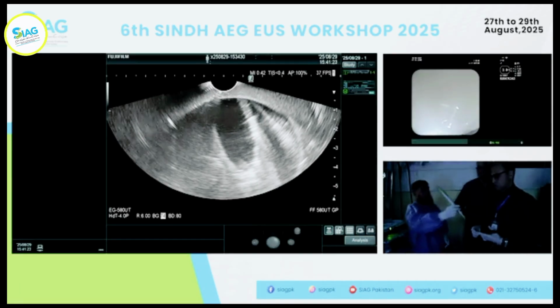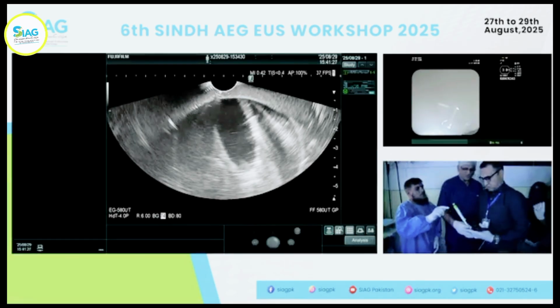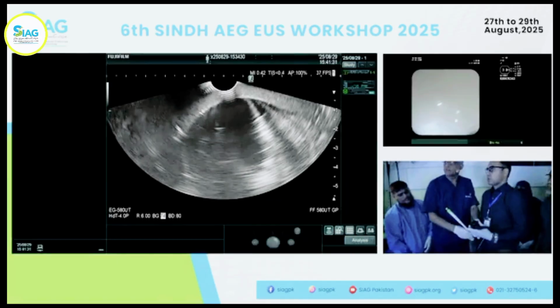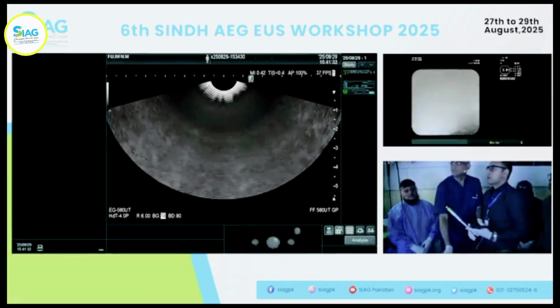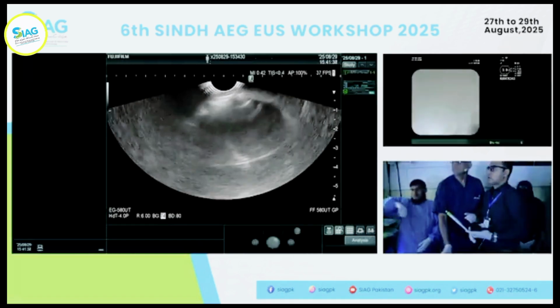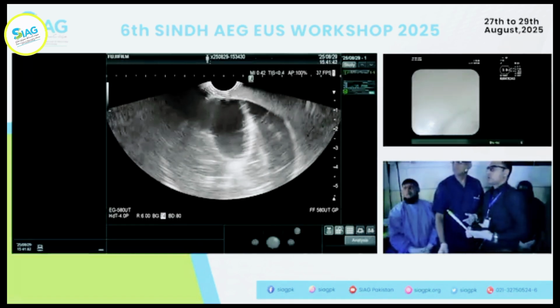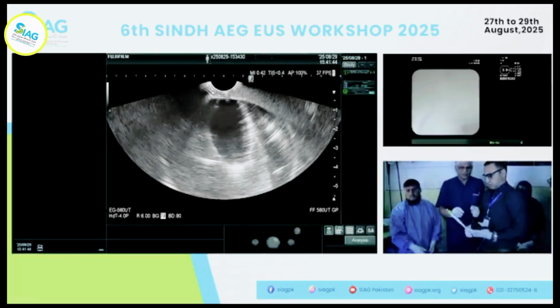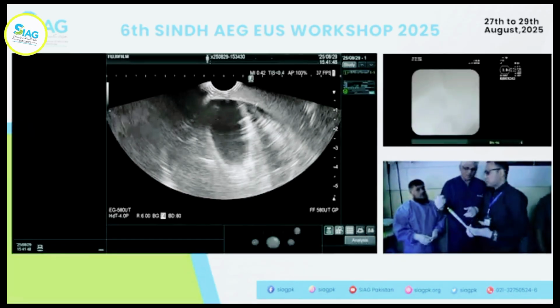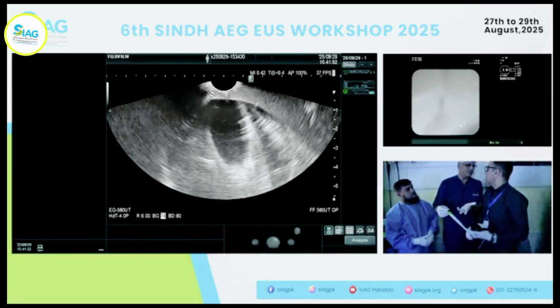Right? Yeah, it's in a nice place, and so I think we need to maybe pull the scope back a little bit to have a better trajectory. Yeah. Lift up, big wheel up करें। Right? Okay. Now, before you do anything else, you've got everything connected. Because you are aspirating a cyst, right? Yeah. So you can actually go without this as well.